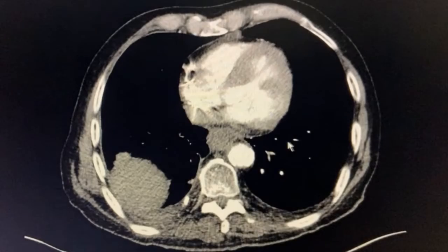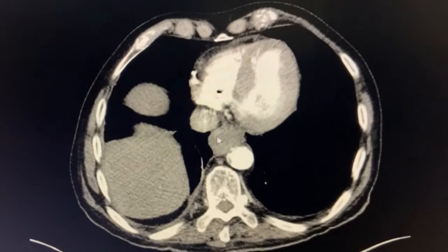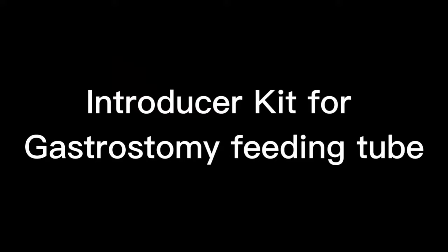Here we can see the CT showing the distal esophageal mass that is causing severe dysphagia, and that's how the endoscopic view of the mass looks from inside the esophagus. As we can see, the mass is causing compression and ulceration to the esophageal wall.